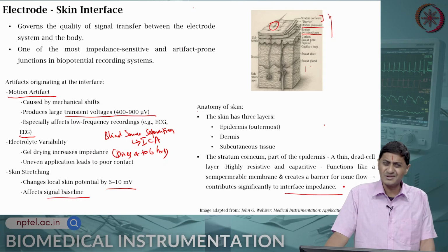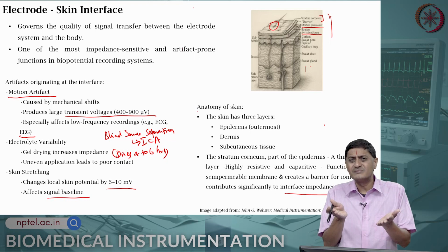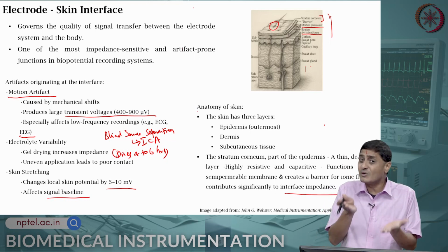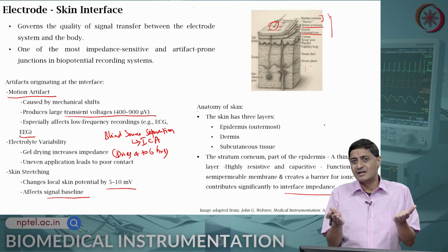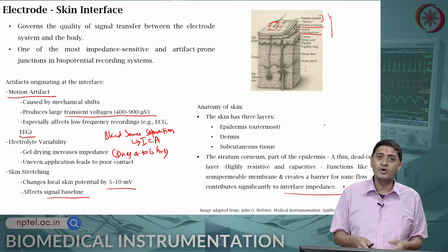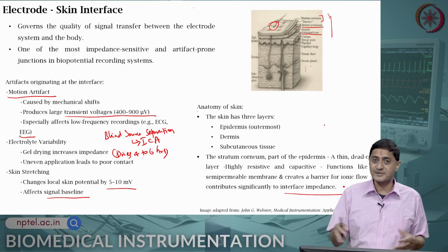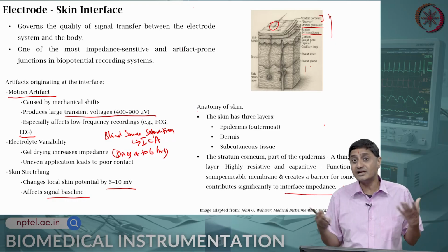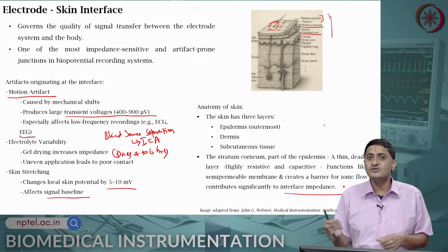So almost all the time, you are essentially balancing between the comfort of the patient and the quality of the signal. You need to balance the two. Sometimes it is more important for us to record the signal than to worry about the physical comfort of the patient, because the patient might be dying, might not even be feeling the pain, for example. Then it is okay to abrade.